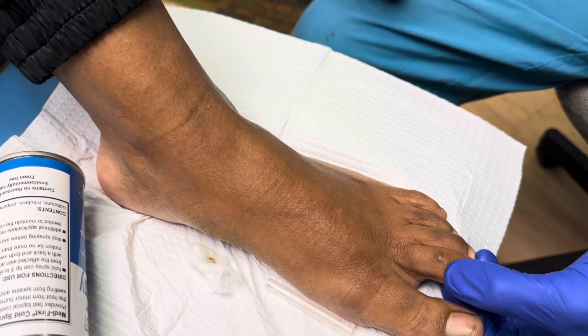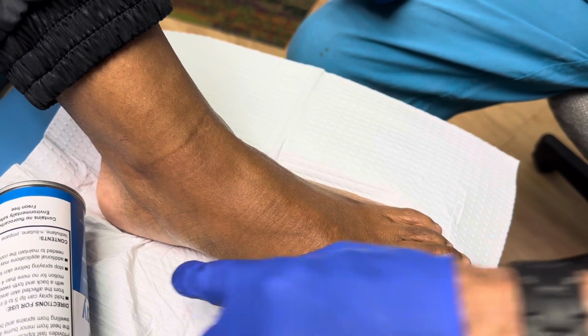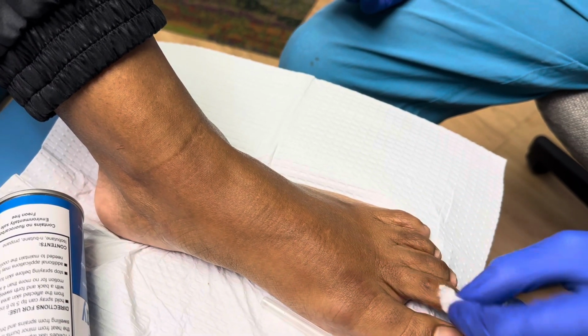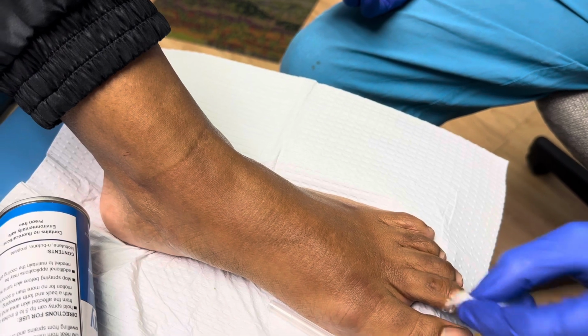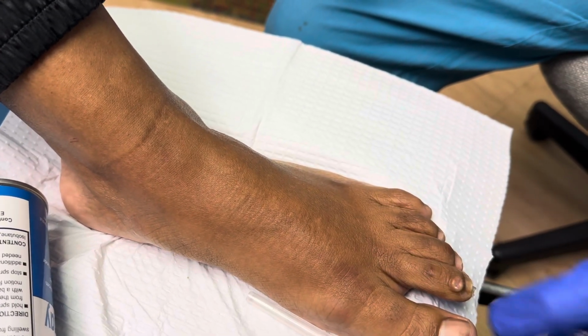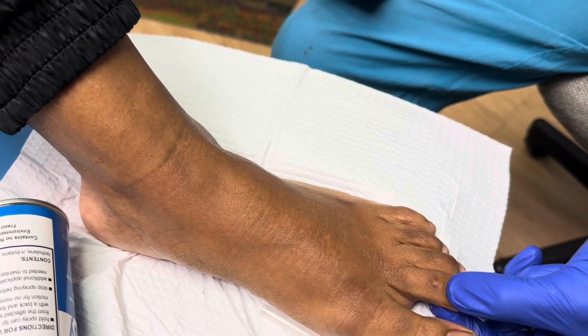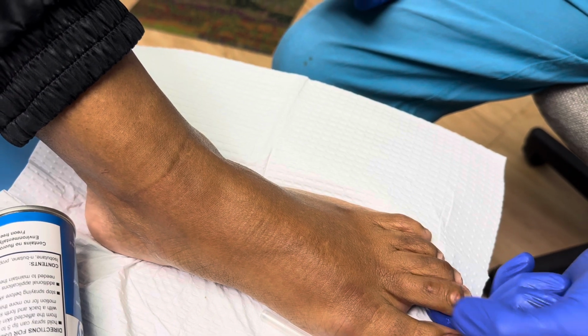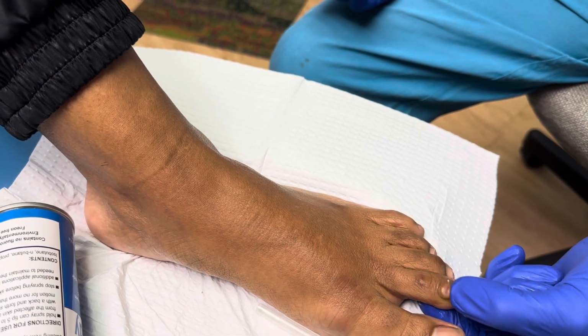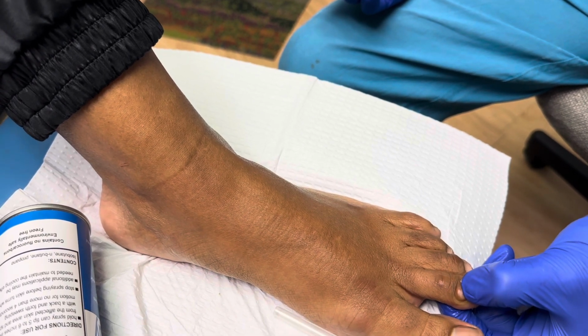Now, the aftermath of this is going to be warm compresses. There's no major immune compromise here, so we don't need to prophylact with any antibiotics. I'm going to clean this up a little bit, and we can see it's already reduced probably about 60% to where it was. And what's going to happen is, as time goes on, this remaining synovial fluid is going to continue to drain, as long as the portals are open.